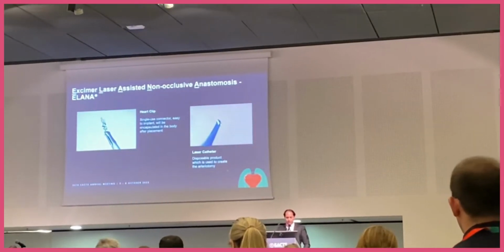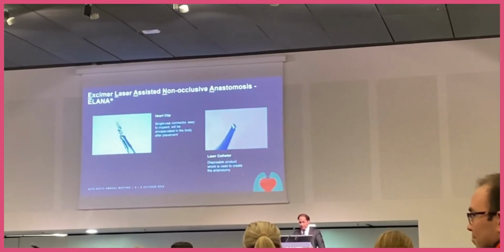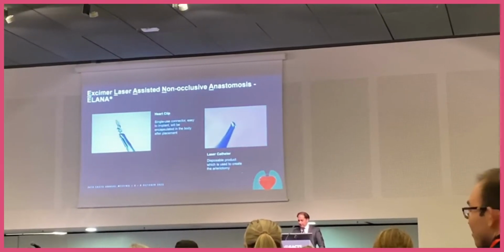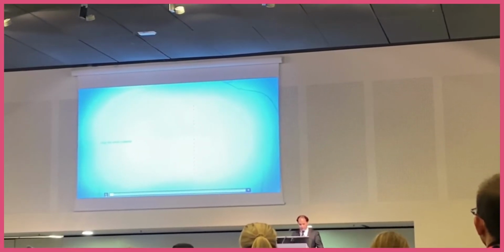It consists of a heart clip, which is a single-use connector, easy to implant, which will be left in the body, and the arteriotomies are created by a laser catheter, with 2 rows of glass fibers in the catheter. This is a short animation of how the procedure works.